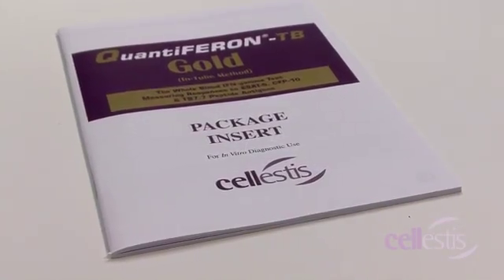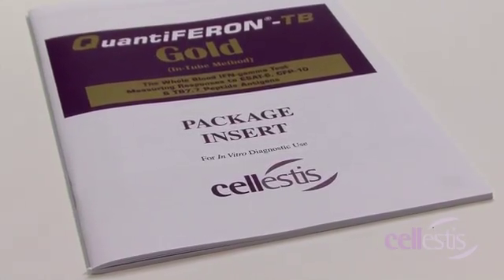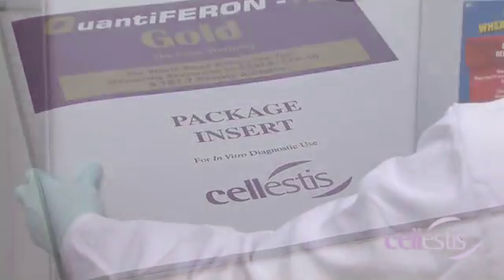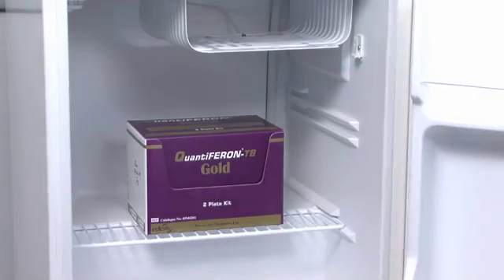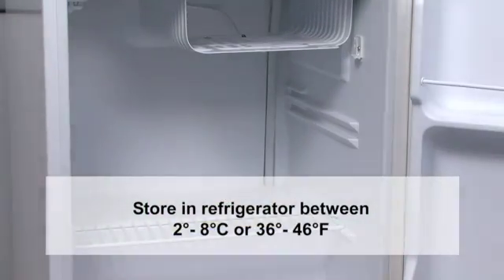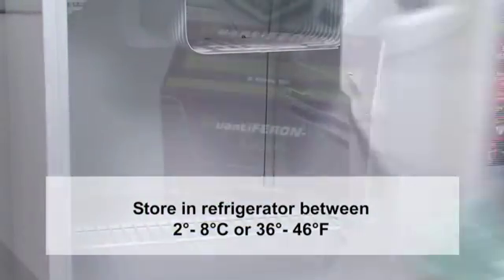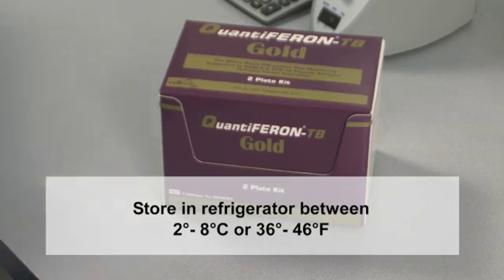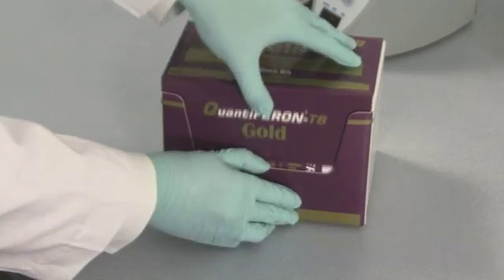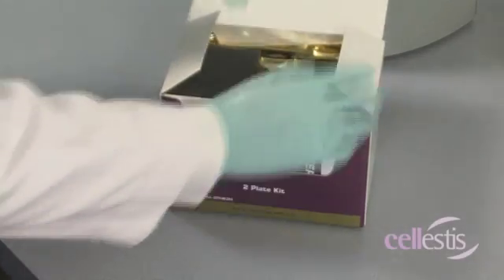Components of the QFT ELISA kit are stored as per package instructions. The ELISA box is stored in the refrigerator between 2 and 8 degrees Celsius, or 36 to 46 degrees Fahrenheit, and should be returned to the refrigerator after each use.